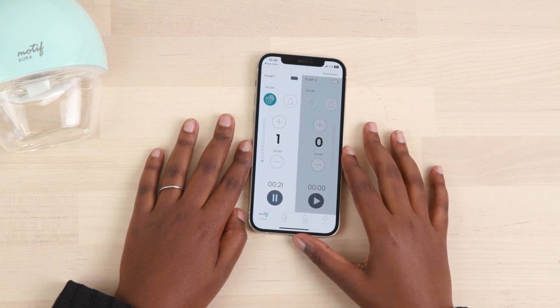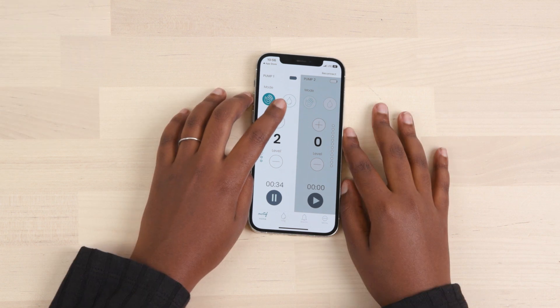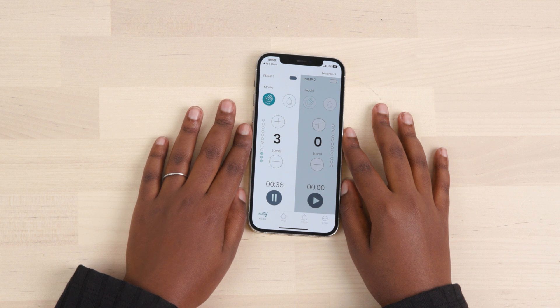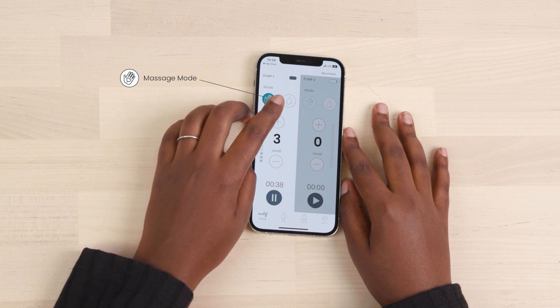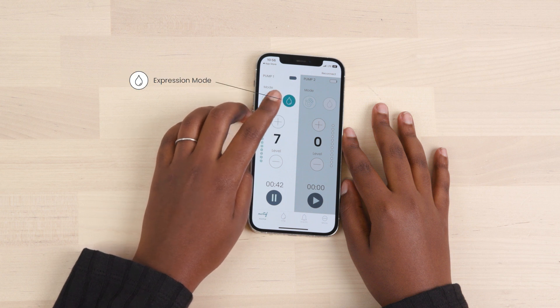From the home screen, you can control each pump individually. To change the suction levels, press the plus and minus buttons. Levels 1 through 5 will activate the massage mode, and levels 6 through 12 will activate the expression mode.